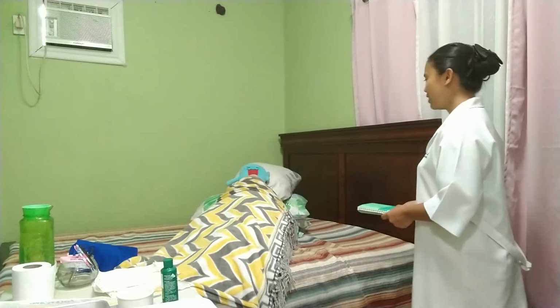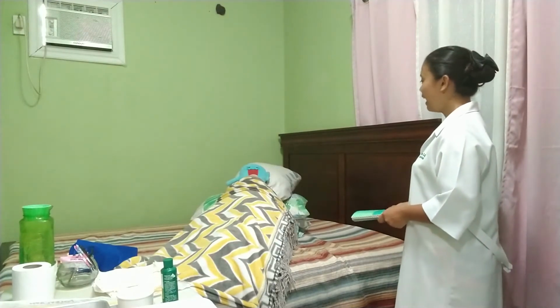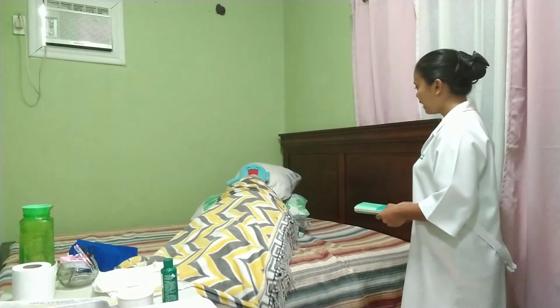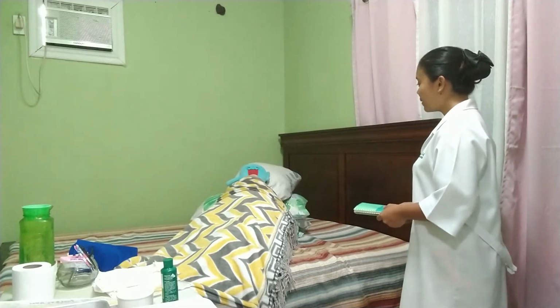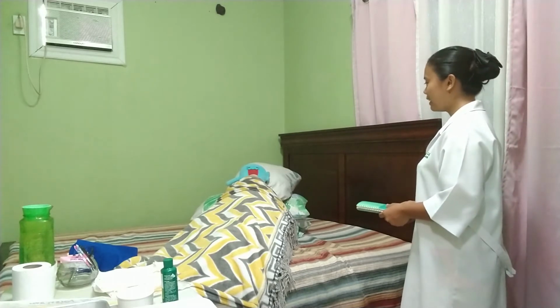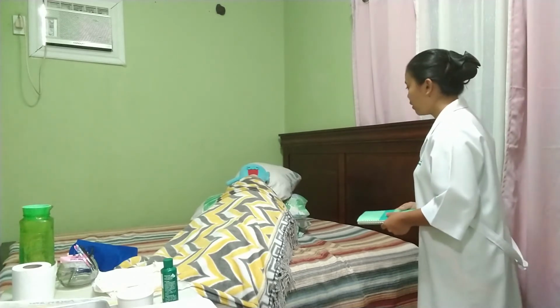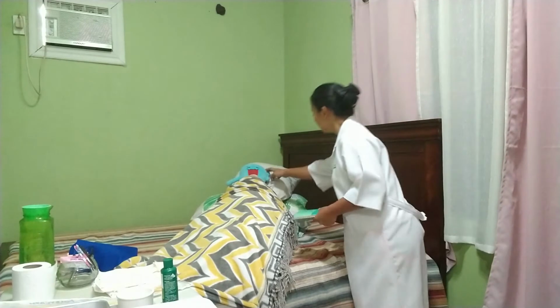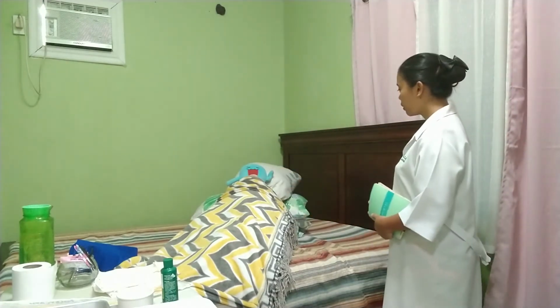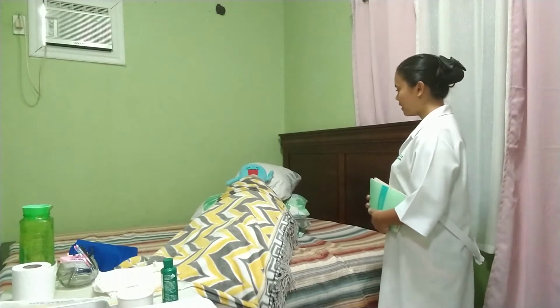Good morning, Miss Angelina. My name is Jelly Franklin, and I'll be your nurse for today. May I know your complete name and your birth date? So your name is Angelina Jolie, and you were born on December 13, 1993. May I check your wristband? Okay. Alright, thank you. Your doctor has ordered to give you a urinary catheterization.